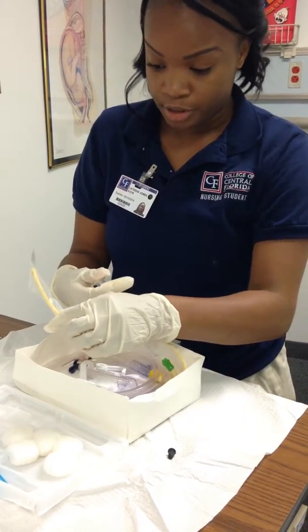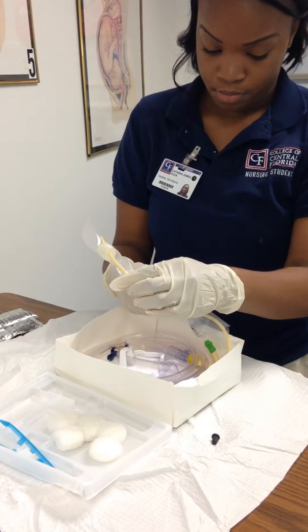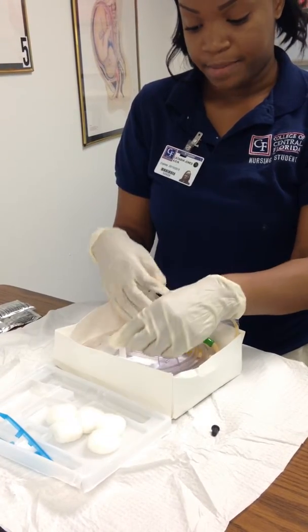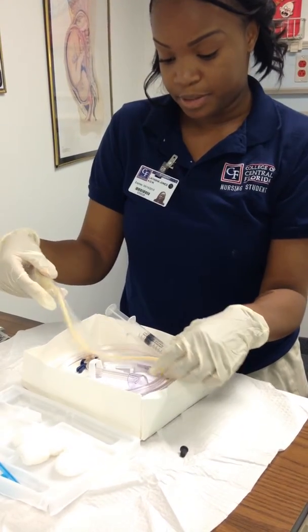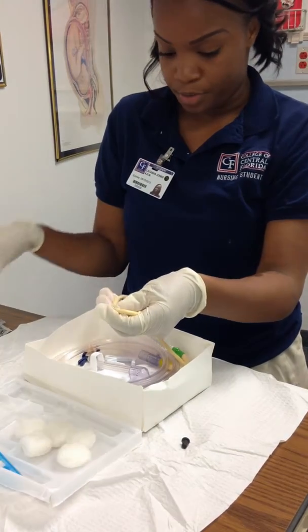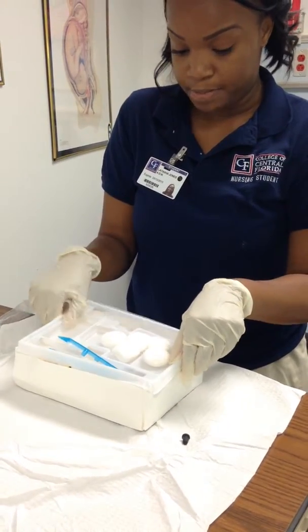And I'm going to be sure to inflate the entire balloon. All 10 cc's are in. There's no leakage. I'm just going to let it passively deflate. While this is sterile, I'm going to take the cover off the tubing and lay it back into the sterile container. Place this back on, and now I'm ready to go to the bedside.